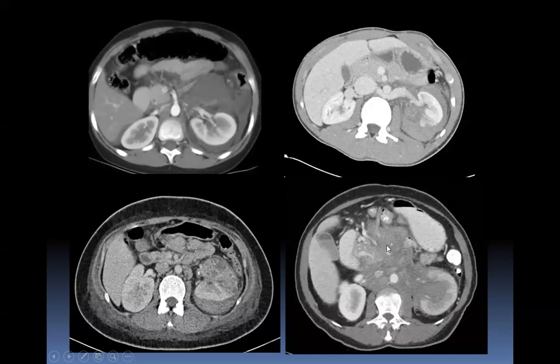But obviously with imaging, you know that this all cannot be blood. It's encasing these vessels. And what about this? You see a patchy, striated nephrogram here, and then there is some collection around it.